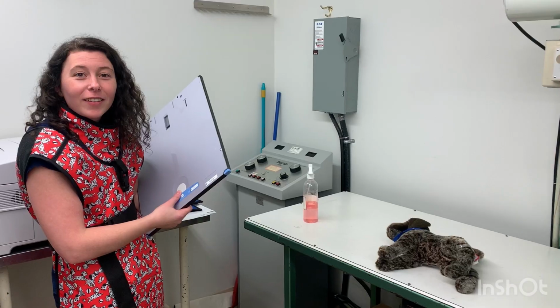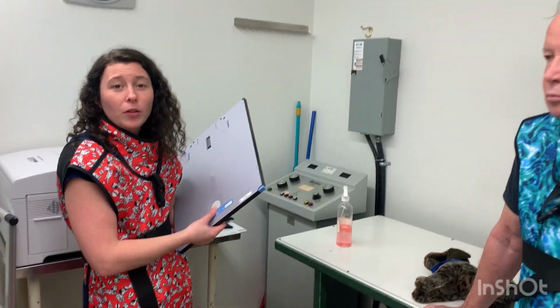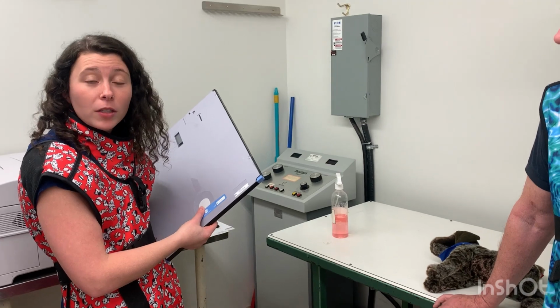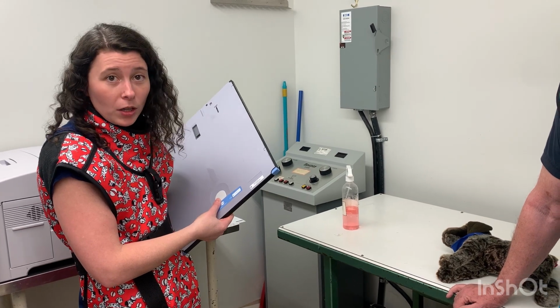perform exam. Okay, hi, my name is Sam Kipp and my student number is T00698764. You're the clinical mentor, Dr. White. We're going to be taking abdominal x-rays here of our patient today. We're going to be taking two views. We're going to be taking a view from the right lateral position and a view from the ventral dorsal position.